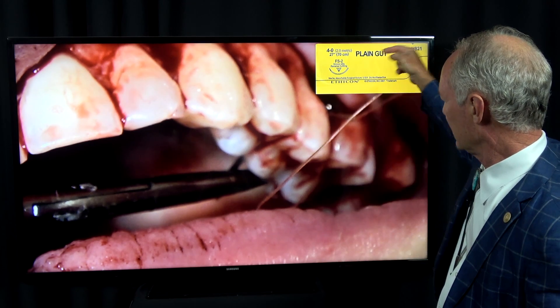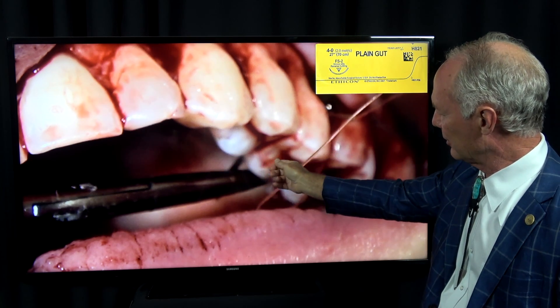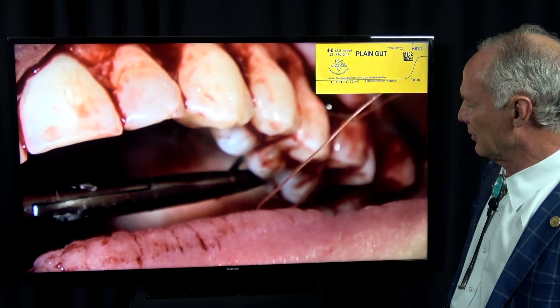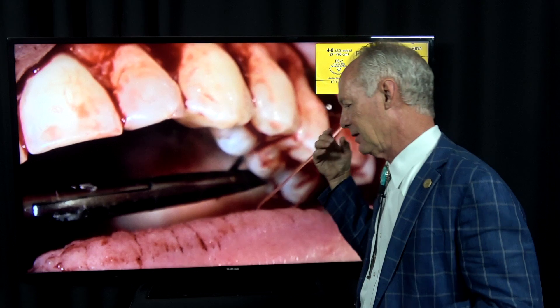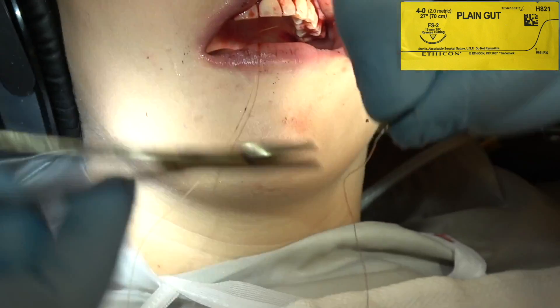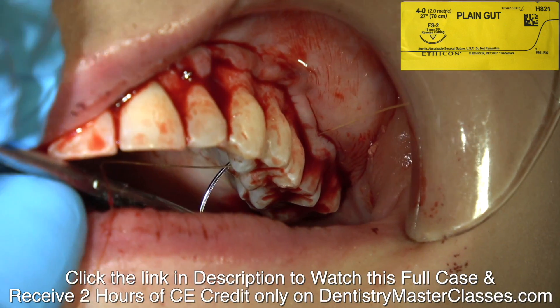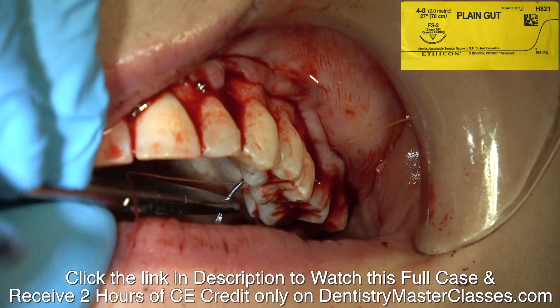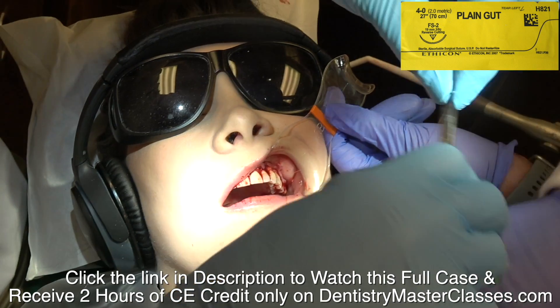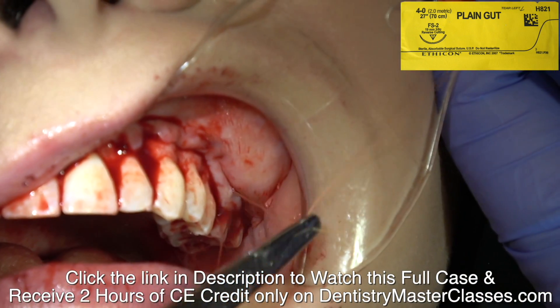So when you're suturing, you go through the flap, then through the interproximal area, then when you come back through you go through the tissue on the palate. We've anesthetized the greater palatine nerve and the nasopalatine nerve so they're not going to feel it when you take the needle through the tissue on the palate. So this suture is anchored by the palatal soft tissue.